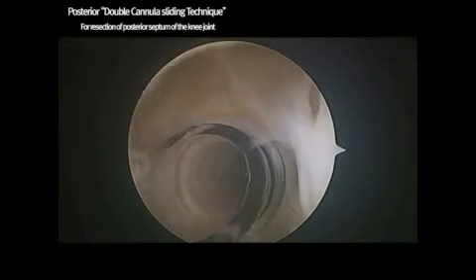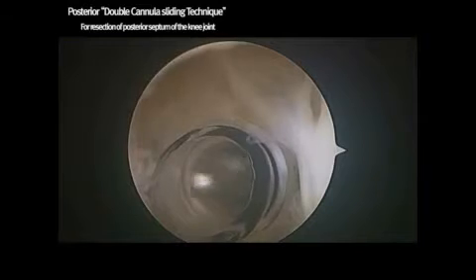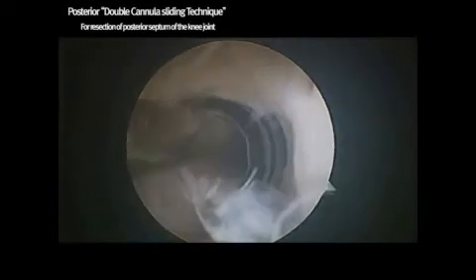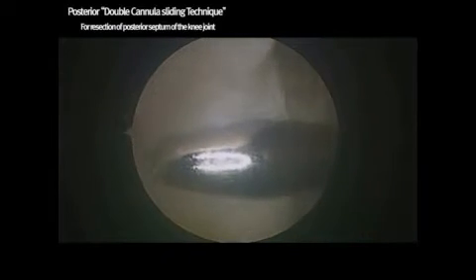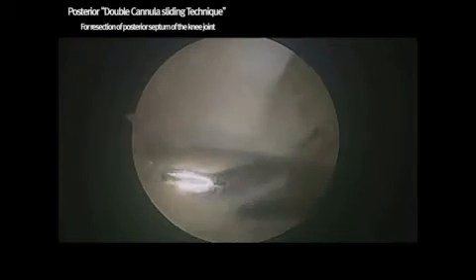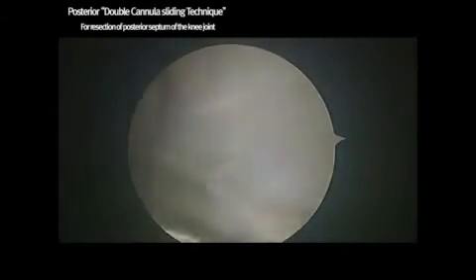A switching stick is inserted through the posterior medial portal, and placing the arthroscope at the 9 o'clock position, but not beyond the posterior condyle, the switching stick is gently passed through the posterior septum in the direction parallel to the posterior condyle.